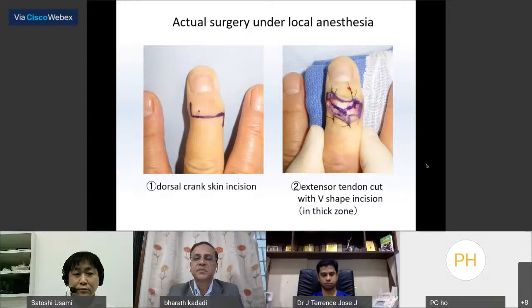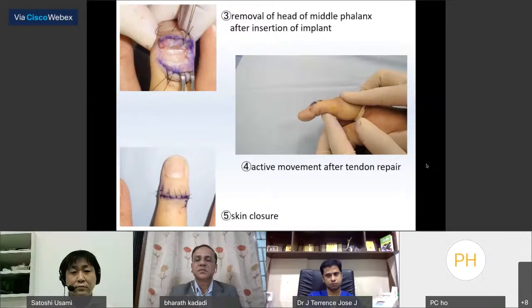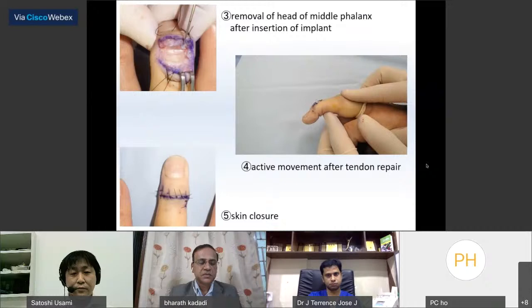In the actual surgery for DIP arthroplasty, we use a crank-shaped skin incision above the DIP joint. After the dissection of subcutaneous tissue, the extensor tendon is cut in a V-shape in the terminal tendon. After exposure of the DIP joint, the head of the middle phalanx is removed with 3 mm length using a bone saw. Thereafter, the silicone implant is inserted. In the end, the extensor tendon and joint capsule were strongly sutured. This movie is an intraoperative active range of motion after extensor tendon repair.